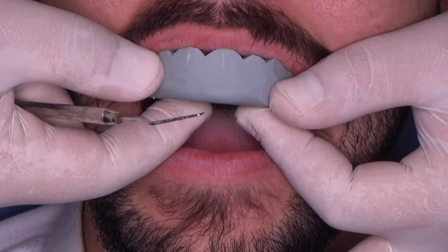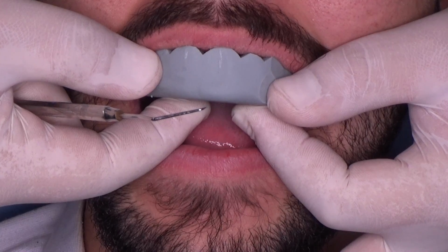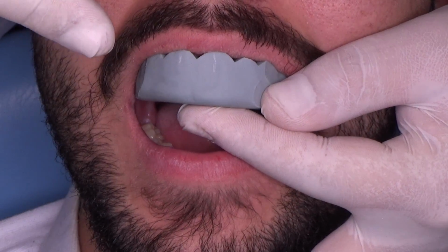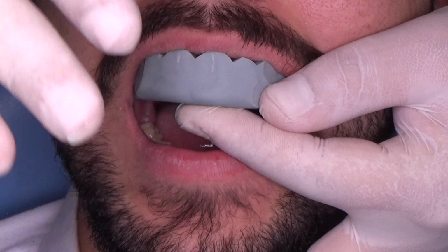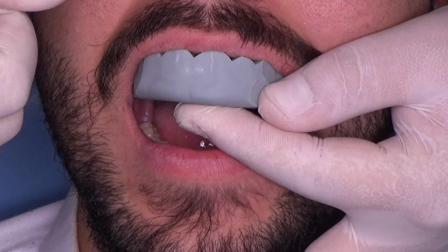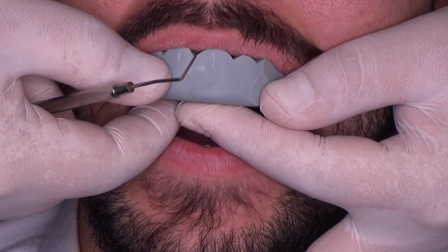What if we have to remove from the central? How do you do the mock-up on the one central? So in such cases, when you have to remove, the mock-up is perforated by the tooth, which means the edge which should be removed goes through the mock-up. And you can mark it with a black pencil to see which part should be removed. First remove this part and then continue with the standard procedure.